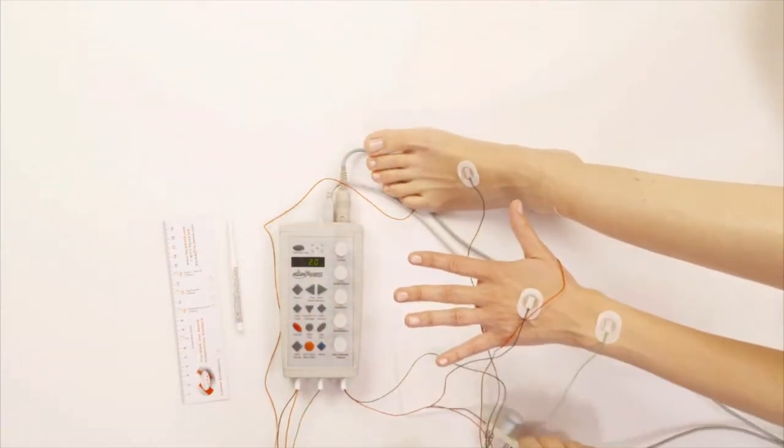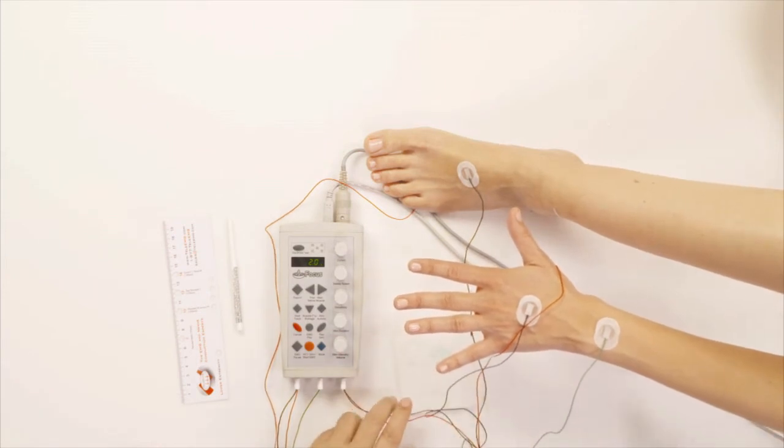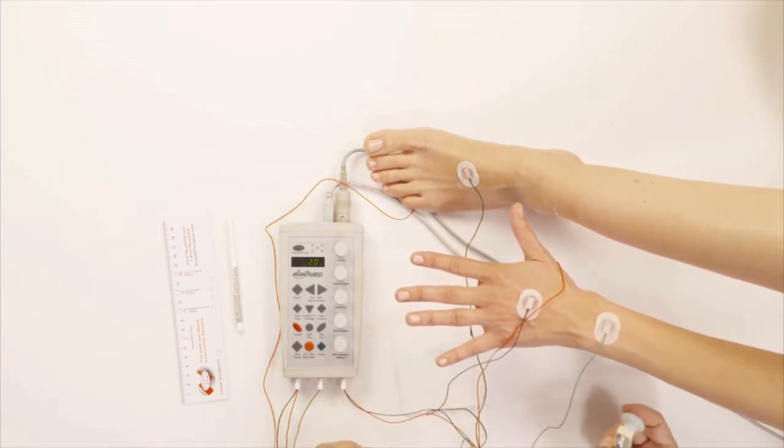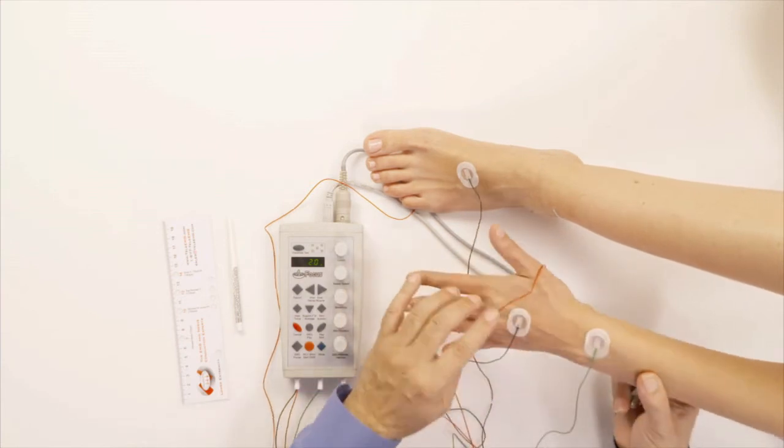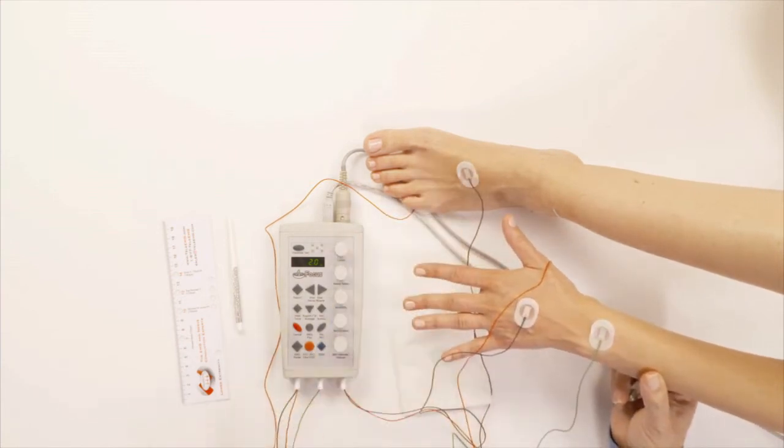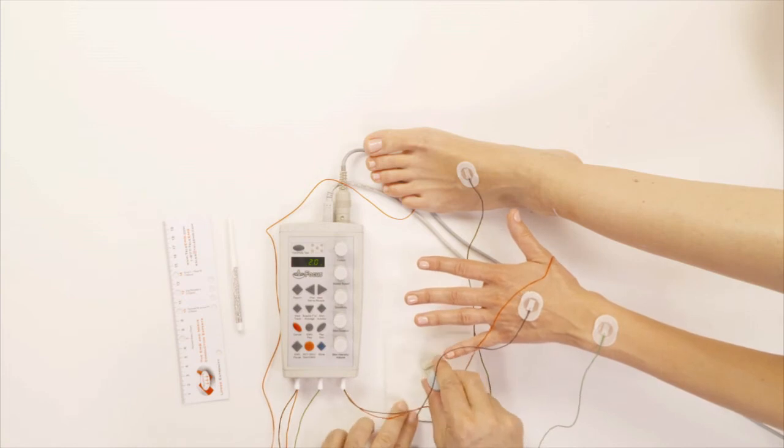So now in order to do the test, all I have to do is stimulate the median nerve. And by stimulating just the median nerve, we're going to get a response both from the hand up here and from the foot. The response is going to be slow because it's going to take some time to go up and come back, but it will appear.